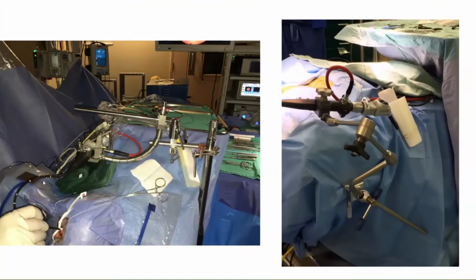You cannot clamp the flexible part of the scope. That will basically crush the fiber optics. You can only hold the camera. So this is basically a flexible Greenberg that's holding the camera. Most of these kids are obviously very small in size and weight, so you can't really put this big bulky camera on the patient. It's just not practical. So the rigid clamp is actually very useful to stabilize the camera. It frees up your other hand, and you only then need to use one hand to manipulate the fiber optic inside the brain.